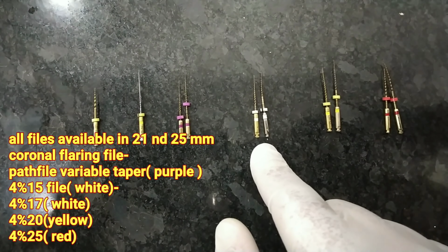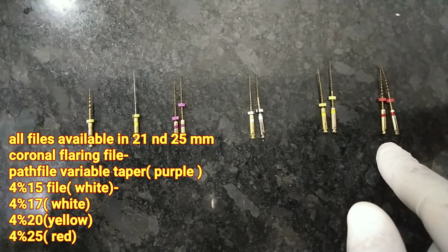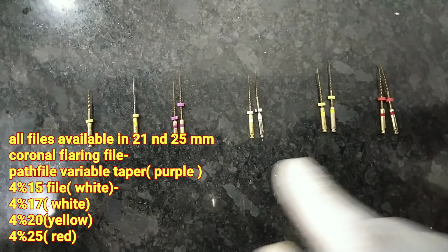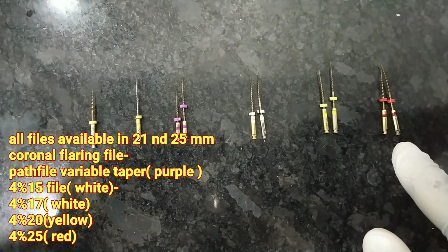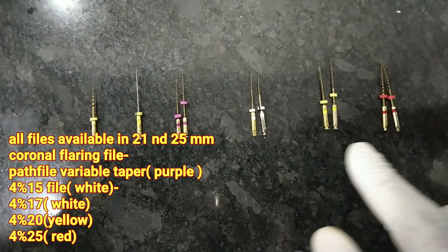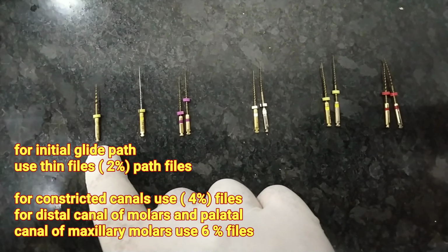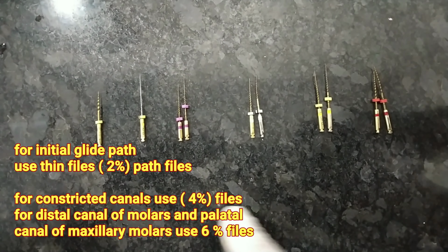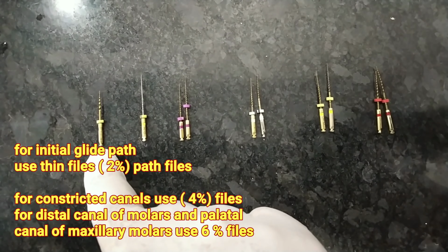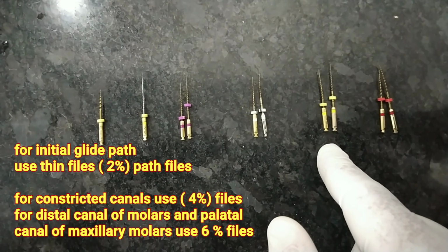It's a 15 number file. We call it a 4% 15. Then this is the 4% 20. This is the 4% 25. Similarly, there are many different files of various different ttapers. So this is all 4% taper files. So these are the coronal flaring files. For the beginning, you just need to know the sequence. After that, in the advanced course, in the later classes, I'll be telling you regarding what file systems, whether you should use a 4% or 6%.